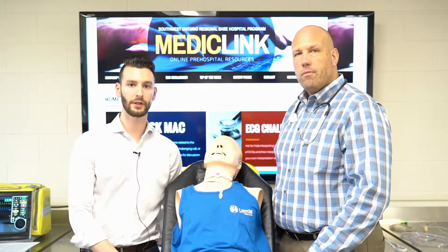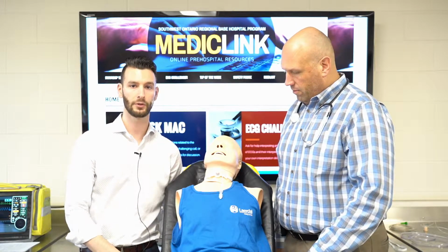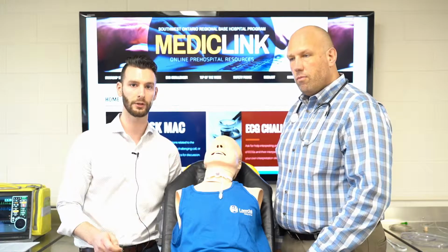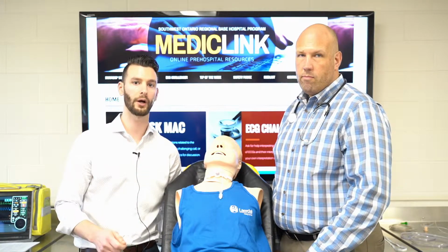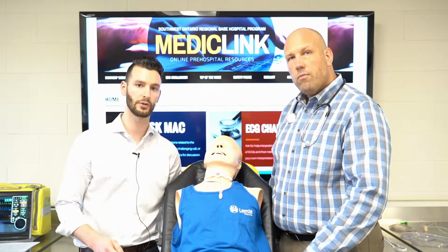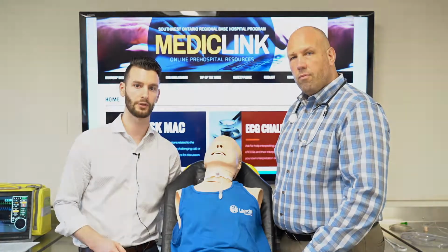When arriving on scene, we want to differentiate between the tracheostomy and laryngectomy patient. You can see that we have a tracheostomy patient here. So this is a great time to pull out our emergency flowchart. There is a difference between the tracheostomy and laryngectomy patient, so let's make sure we pull out the correct flowchart. Now that I've already done so, we're going to apply our PPE, look, listen, feel for breathing, apply the cardiac monitor, our SpO2, our end tidal, and oxygenate this patient. Then we're going to reevaluate for any further interventions.